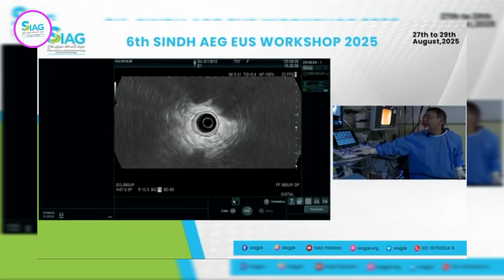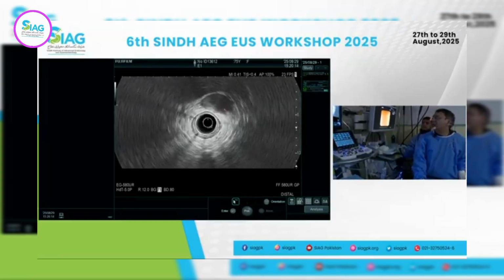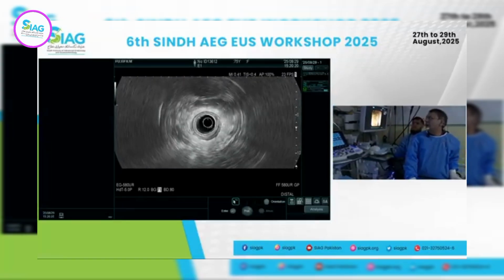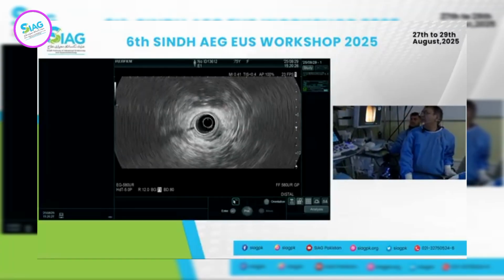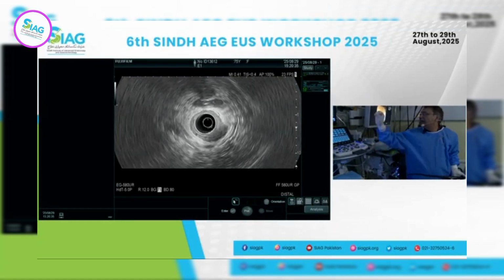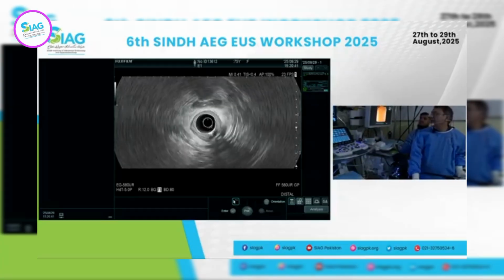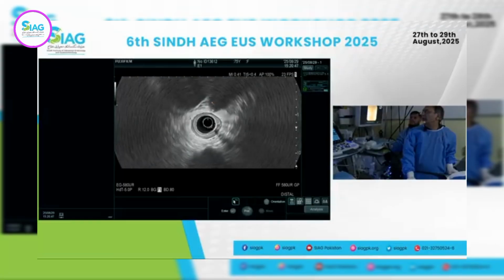Here we see the bladder, and in this case this looks more like a cervix or uterus, but I'll pull back a little to get an idea. This looks more like a cervix because it's a solid organ. Then as I come back it disappears and you will see some air there. You see the air, and it gets collapsed. So that's the vagina; it just gets collapsed, and you sometimes see air there as well. Then there is a cervix there, and the bladder above that.